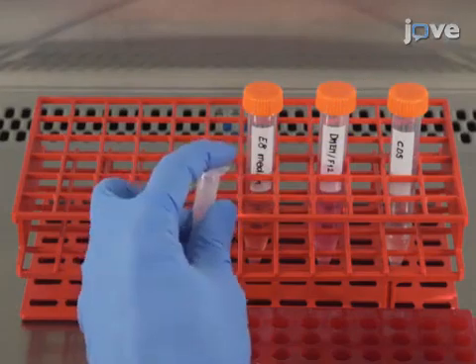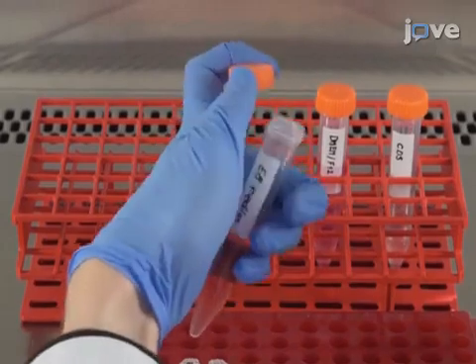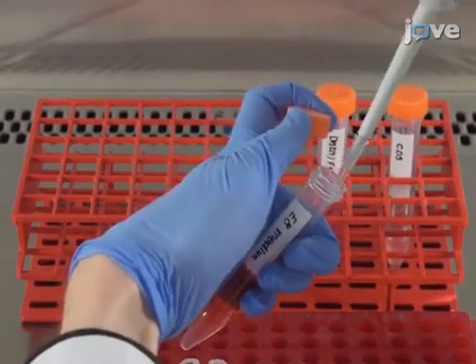Next, add doxycycline to E8 medium to make a final concentration of 4 micrograms per milliliter, and then add rock inhibitor to the mixture.